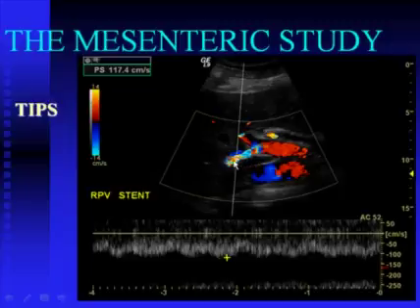If there is a stenosis within the stent, which is the most common cause of failure of these procedures, there will be a stenotic intimal hyperplasia develop within the stent, which will lead to closure or the absence of adequate emptying of the portal vein. You will see, again, the patient will revert to hepatofugal or retrograde flow in the portal vein. You will see evidence of stenotic flow within the stent and post-stenotic turbulence downstream from that, even on the venous side.